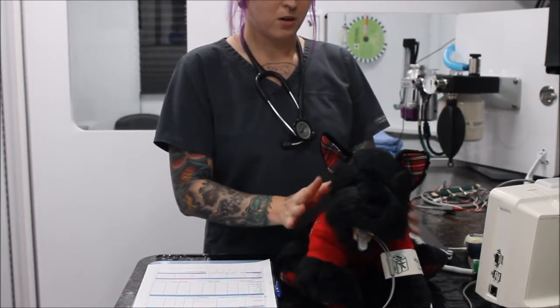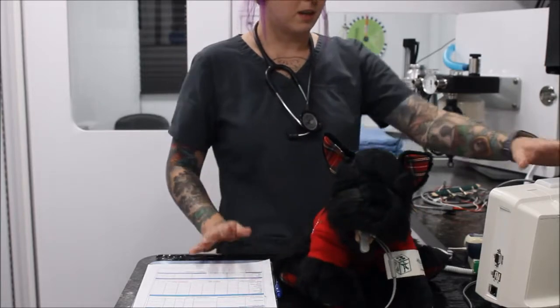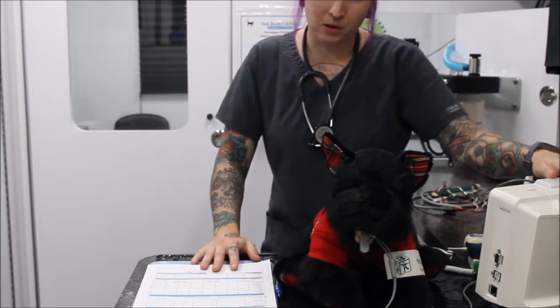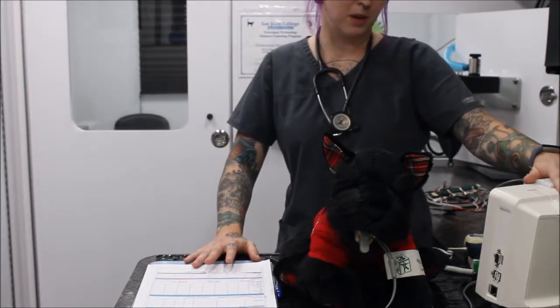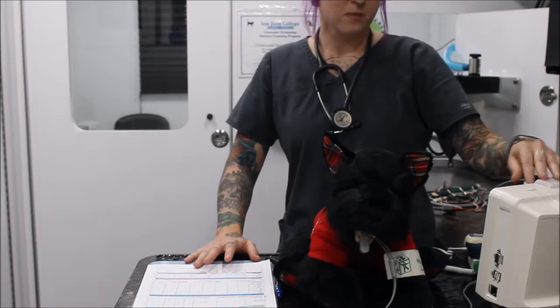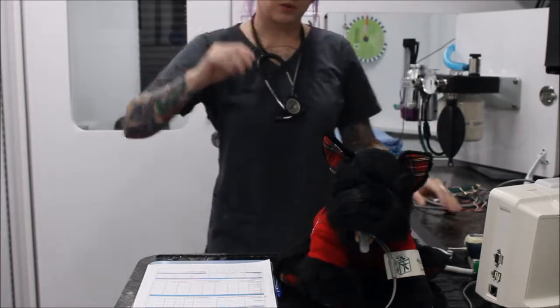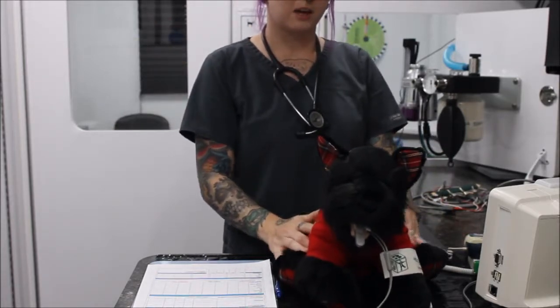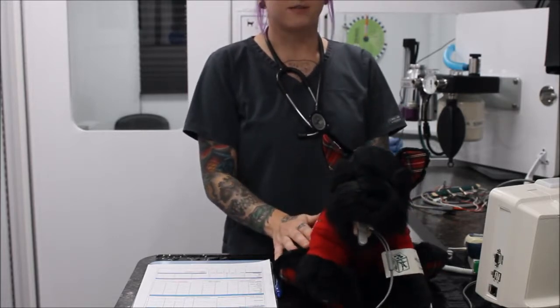The other one that we like to check is respiratory rhythm. Our capnograph on the monitoring system can help us monitor the respiratory rhythm in the waves. As they exhale, it plateaus, and we watch for a nice steady rhythm. We're watching our patient, and we want nice steady deep breaths. We don't want any sporadic breathing.